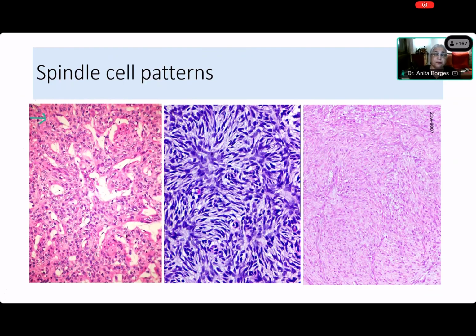Exactly. So many spindle cell lesions have a hemangiopericytomatous pattern. This is a spindle cell lesion, except that it has been cut so that you can't see the spindle cells except in some particular areas, because the spindle cells are in a haphazard pattern, but they have a consistent relationship to the vasculature. Okay. So this is a pattern of the vasculature. Very good. So now you can see this vasculature, and if you look at it, it is a staghorn vasculature. Can you see this? That's a stag. A stag is a male deer. Among some deer, only the males have got horns. So this is a staghorn, and you see how beautifully this vasculature really represents the way that the stag or the male deer's horn looks like. So this is what is called a staghorn pattern.